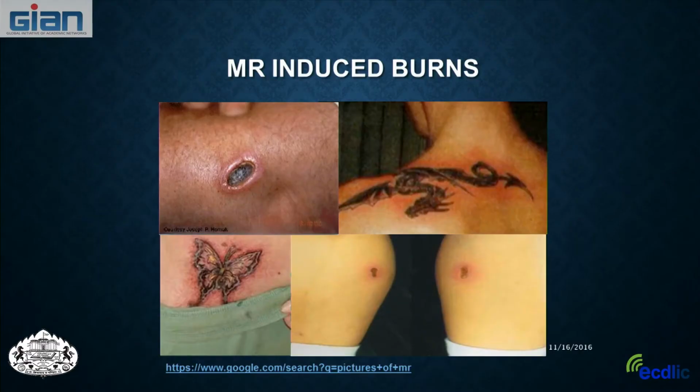Another issue that we deal with in the U.S. is tattoos. Some of the older tattoos that people have, or if they got a tattoo while they were in prison or somewhere where a standard technique wasn't used, sometimes they have metal in them. We've had people that had scans with tattoos where the metal in the tattoo actually pulls towards the magnet, and it results in irritation to the tissue and burning.